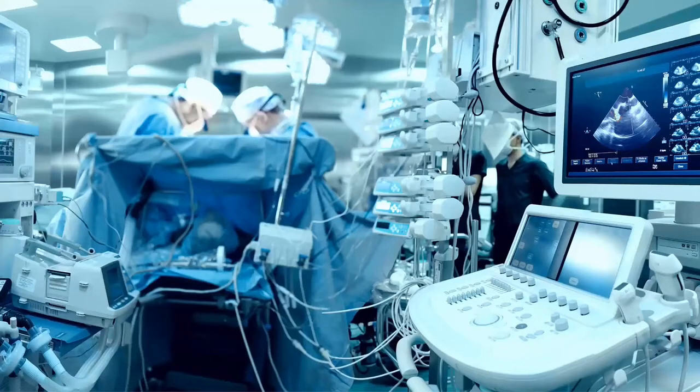Yeah. So I've just been holding on this slide for a little bit because I want to illustrate the point. The next discussion is about the environment of use. So graphical user interfaces often are positioned like this. This is not atypical of what you will find in operating theatres and medical devices. Even devices that are used in patients' homes are quite often not optimally set up.